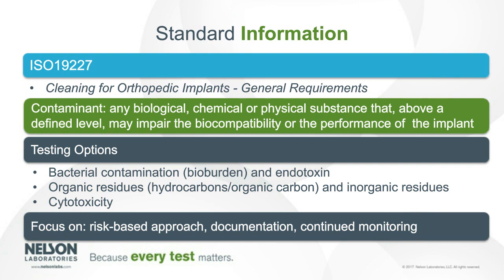This document really isn't changing anything about the way that cleaning validations have been done for probably the past 10 or 20 years that I've been on board. So this isn't anything new, but it's ISO formalizing how all of this is done in an actual document. The standard also gives guidance on continued monitoring. I think manufacturers do a good job of setting up an initial validation, but often forget to set up a routine monitoring plan so we can have a check on that cleanliness throughout the production of these devices and products. And so routine monitoring also takes a role in this new ISO document.